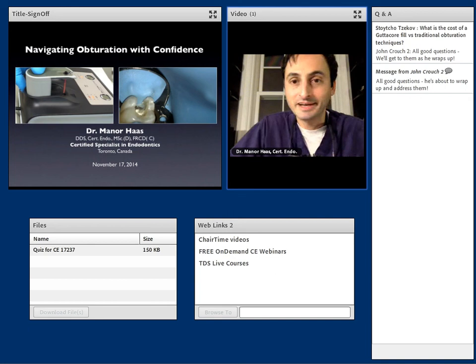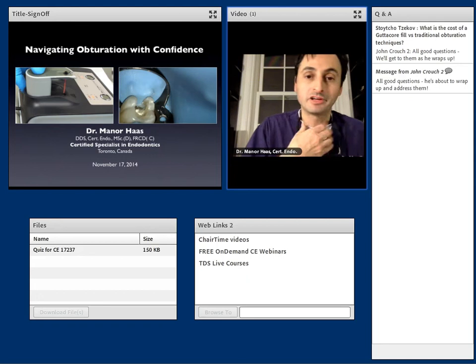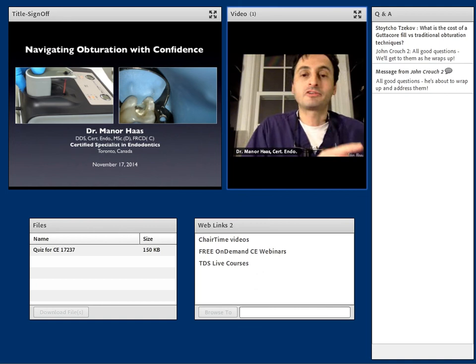Someone was asking, can I use a ProGT oven? You probably can. I'm not sure exactly what setting, but it's a one-time expense. I don't make any money off the sale of these ovens. I wish I did. I'd be in Hawaii right now if I did. But I do recommend this new generation of ovens. It's really meant to work with this system seamlessly. So it's something I would recommend, to have it warmed up properly.